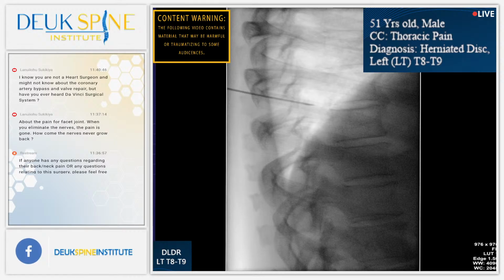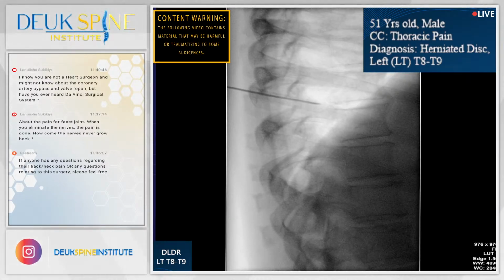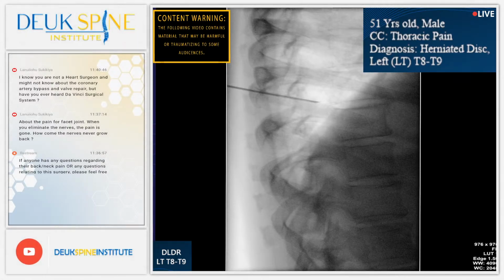So let's try something a little different, raise one side. To me, I think that's better. You don't think so? You do? I do, yes. All right, let's see what that is. Hitting bone. Shot. Question is, I must be hitting the top of the pedicle. So let's go back to an AP view. 12, 11, 10, 9, 8. We're at the right disc, which is good. We're almost there.